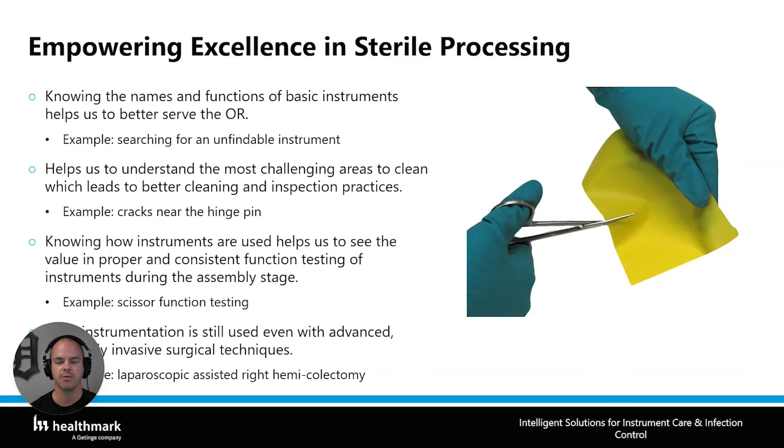So, they're taking out the right side of the colon. They're going to do part of the case laparoscopically. And then a lot of times they're going to pull some of that bowel outside of the body and still perform the rest of the surgery, just like they would have 10, 20, 30, 40 years ago, with regular standard surgical instruments like Kellys and hemostats and needle drivers and all that.